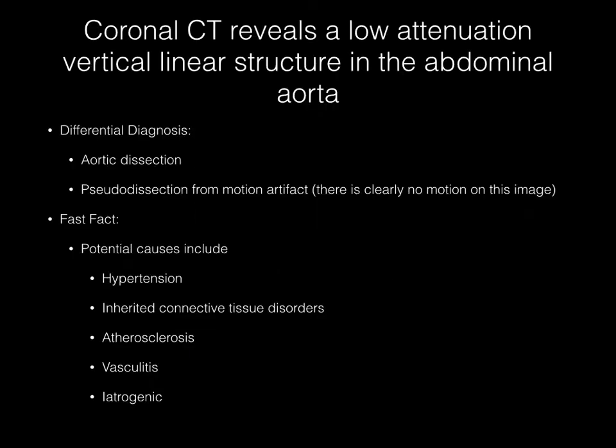This coronal image from a CT angiogram reveals a low attenuation vertical linear structure in the abdominal aorta. The diagnosis here is aortic dissection. You may mention pseudodissection, which might be seen from motion artifact, although there is clearly no motion on this image.